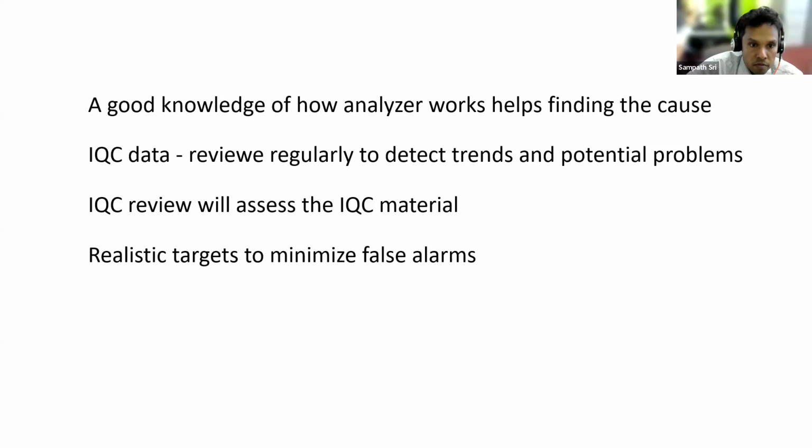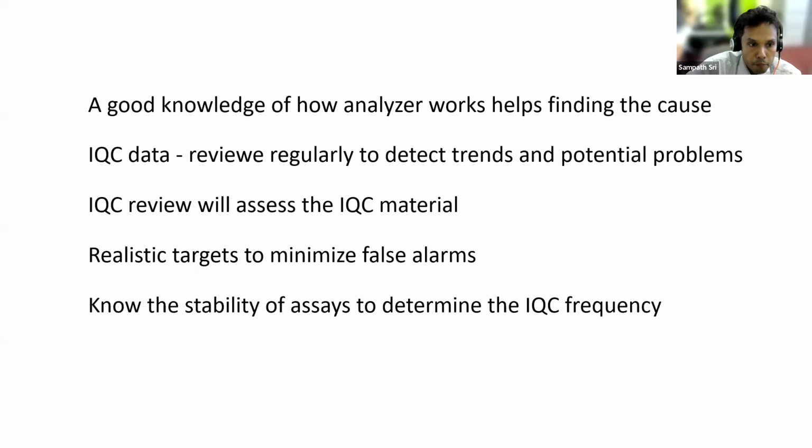When we are implementing our targets, we should have realistic targets, because otherwise we will have a lot of false alarms. And we also should know the stability of our assays before determining the IQC frequency. And we have to know about our QC materials as well.